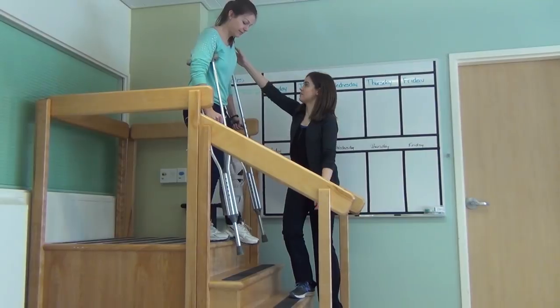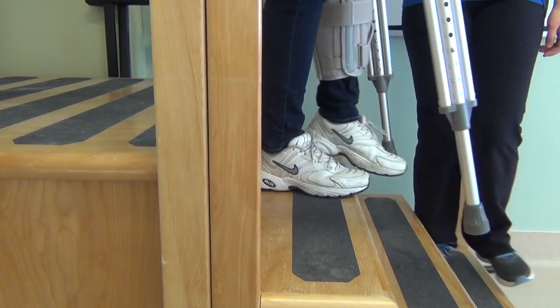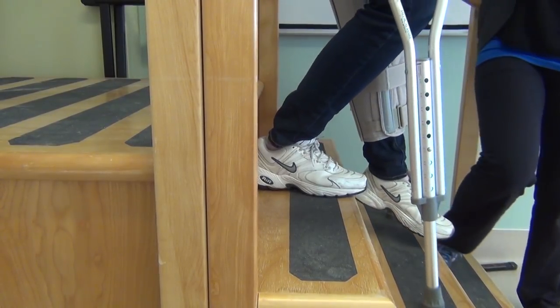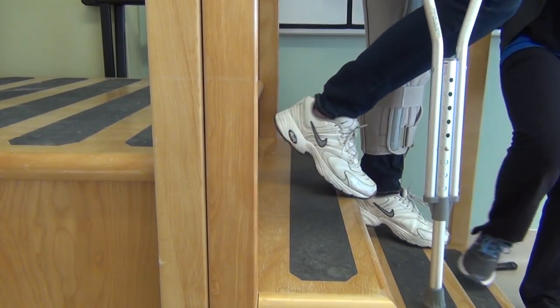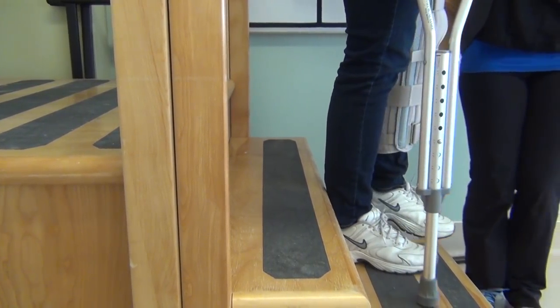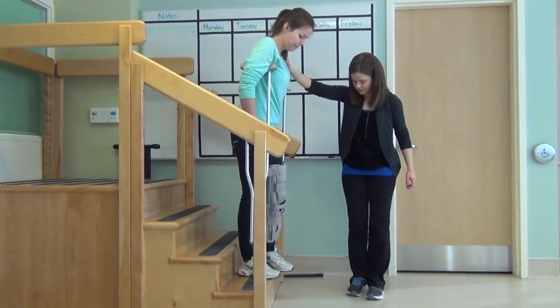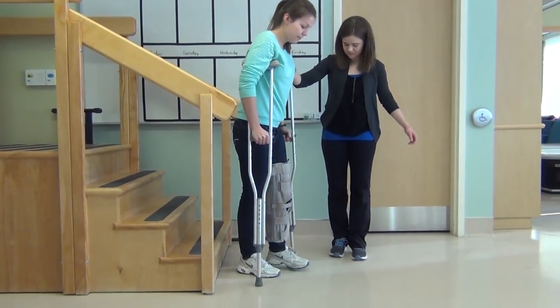Using both crutches to go down the stairs without the railing, start close to the edge of the top stair. Put your crutches on the stair below, followed by your injured leg to help with balance. Remember to only place the amount of weight the doctor has recommended. Place all your weight on your hands and step down with your good leg. Remember, when going down the stairs, the crutches go first.